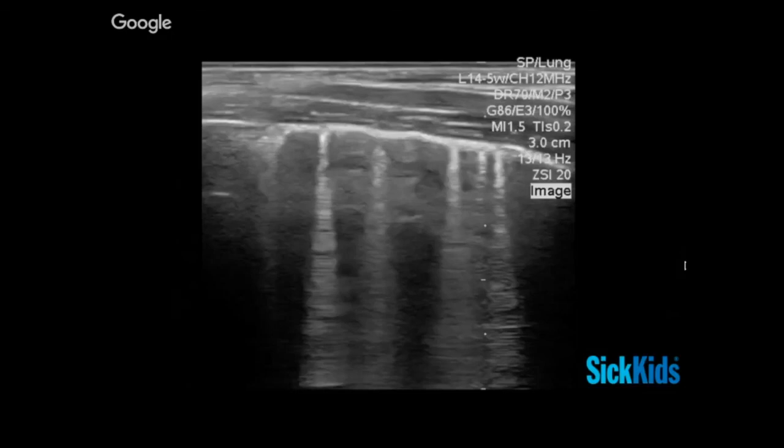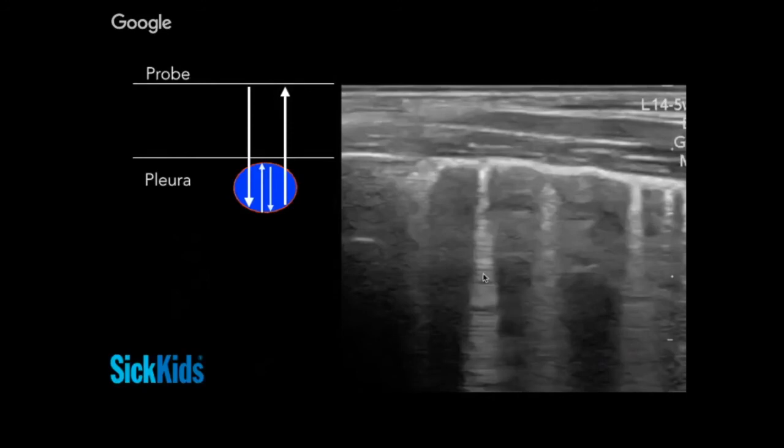Now for B-lines — these headlight or spotlight artifacts shoot all the way down from the pleura to the end of the screen. What's happening is you have wet pleura with a subpleural liquid bubble. The beam can enter that bubble, and the same ping-pong concept applies, only the ping-ponging happens within the bubble: the beam goes in, bounces back to the surface of the pleura, gets redirected to the bottom of the bubble, then escapes — giving you the first of these lines. This can happen once, twice, three times, and every one of those infinite reverberations before release produces another of these tightly packed lines in the headlight artifact.